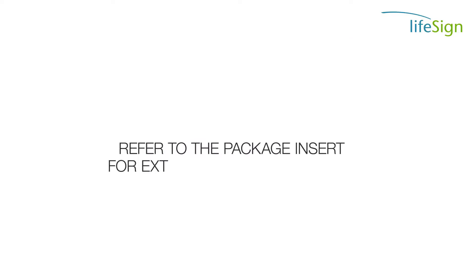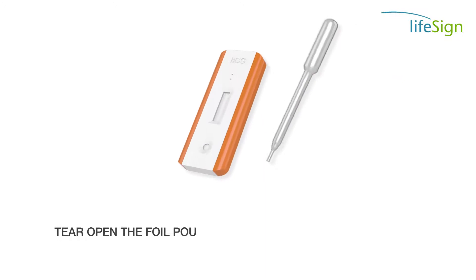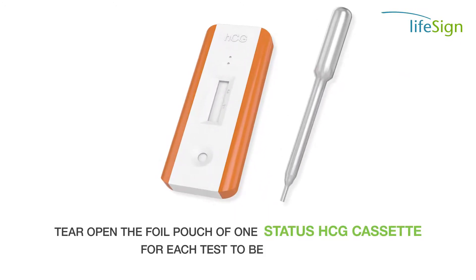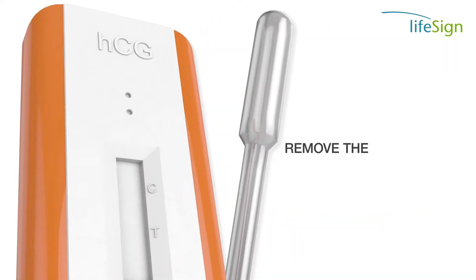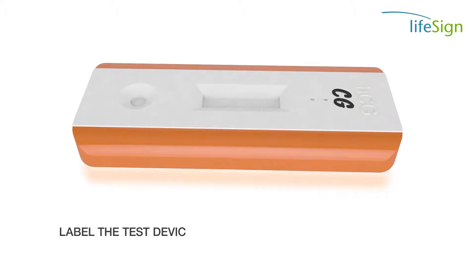Refer to the package insert for external QC requirements. Tear open the foil pouch of one STATUS HCG cassette for each test to be performed. Remove the test device and place it on a flat surface. Label the test device with the patient's name or patient ID.